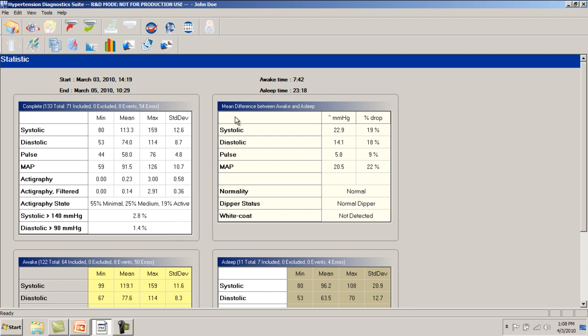The dipping factors display the difference between average awake and asleep measurements for systolic, diastolic, and pulse rate. In version 2.40 of the software and beyond, additional information, including normality and dipper status based on the American or European clinical standards will be displayed. This analysis is helpful to the interpretation of the results of the ABPM study.